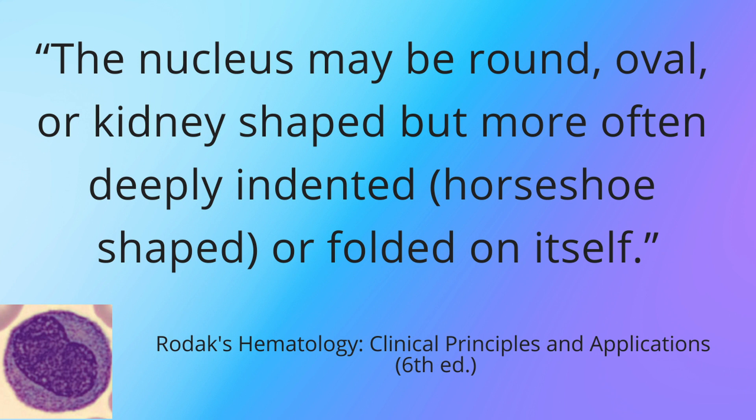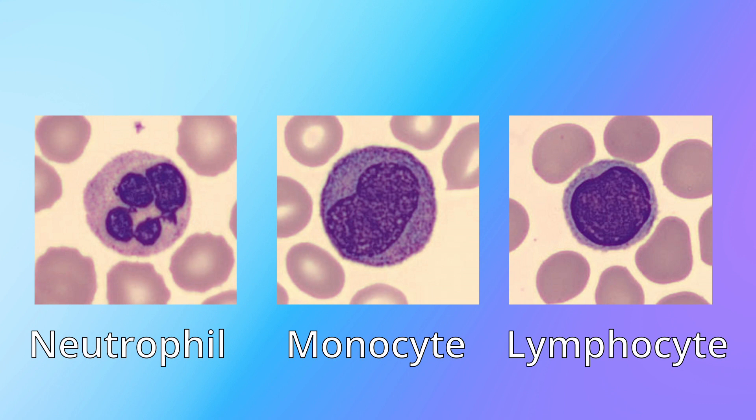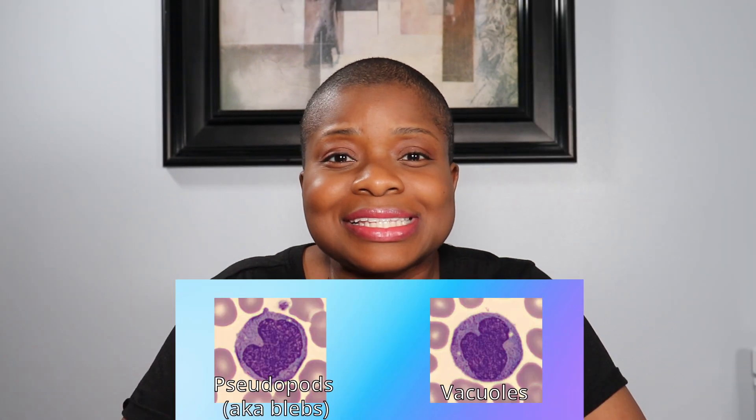On the smear, the monocyte is typically larger than the neutrophil because they tend to get spread out in the slide-making process. As per the 6th edition of Rodak's Hematology Textbook, the nucleus may be round, oval, or kidney-shaped, but more often deeply indented, horseshoe-shaped, or folded on itself. In layperson's terms, the nucleus looks like whatever it wants to. The chromatin in the nucleus will be looser than other WBCs. Nucleoli are generally seen using an electron microscope. The cytoplasm is blue-gray with fine azure granules that give it a ground-glass appearance. Cytoplasmic pseudopods may be visible, and cytoplasmic and nuclear vacuoles may also be present.